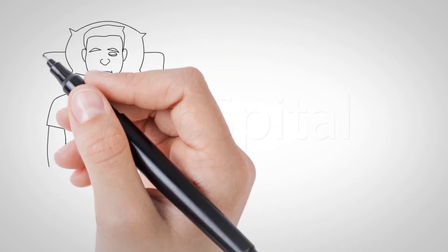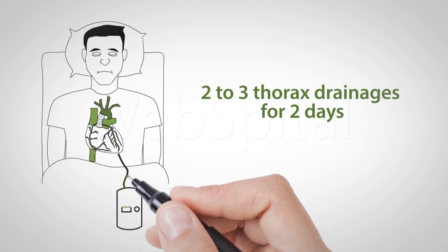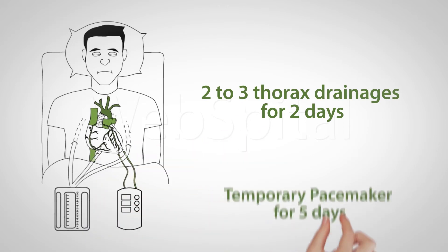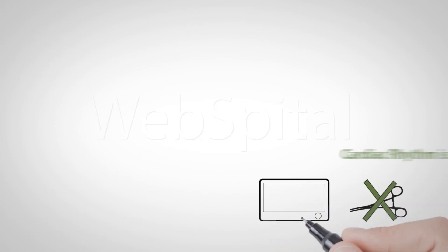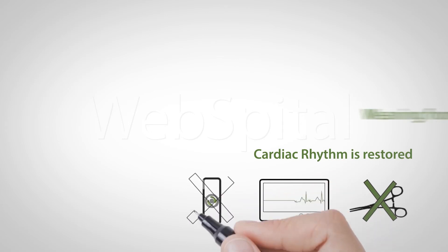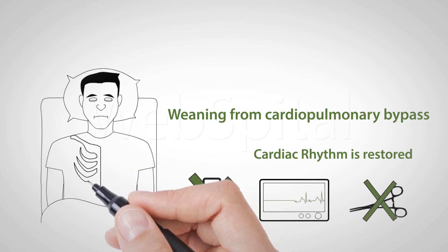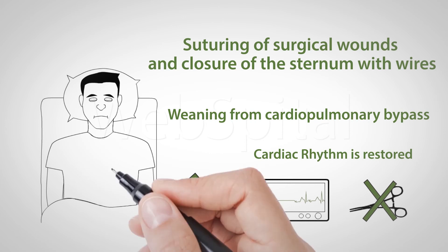After reconstruction is complete, the temporary pacemaker wires are sewn to the heart and two to three thorax drainages are placed in the chest. The wound tubes are removed on the second day and the pacemaker cable on the fifth day after surgery. The aortic cross clamp is opened, which perfuses the heart with warm blood, removing the effects of the cardioplegic solution. Cardiac activity is restored, allowing the termination of cardiopulmonary bypass. The sternum is then closed with sternal wires and the surgical wound with sutures.